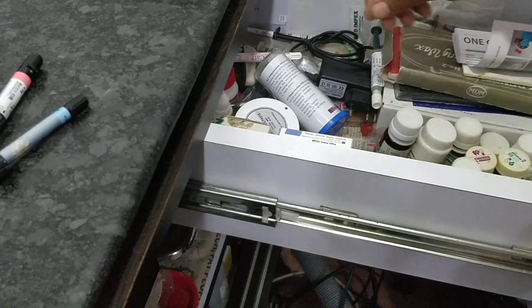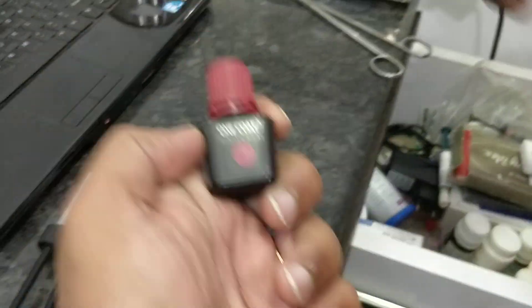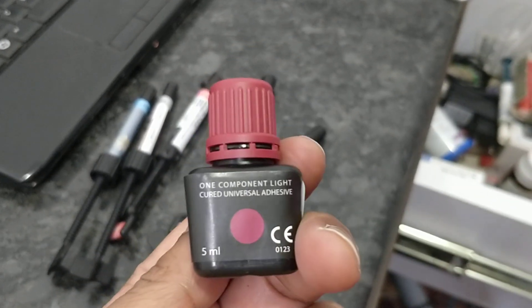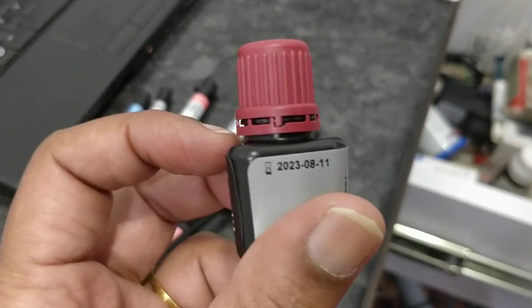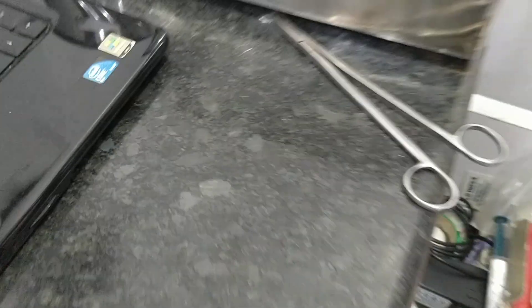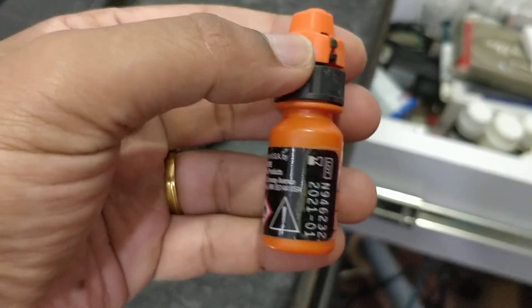The bonding agent — this is the bonding agent I am using now. This is One Coat Seven Universal. The price is around 3500 rupees. We don't need to etch for filling. And there is a fifth generation bonding agent also — sometimes we need to use it while doing ortho cases.